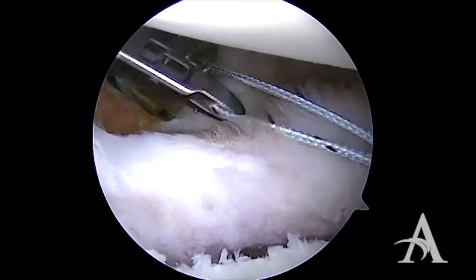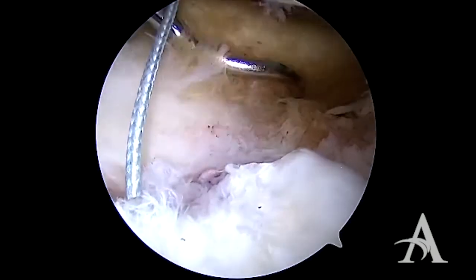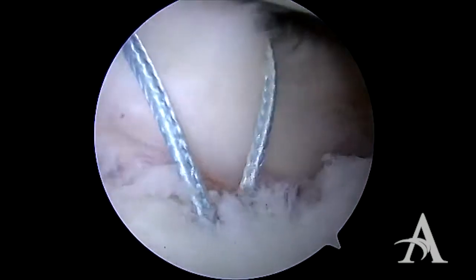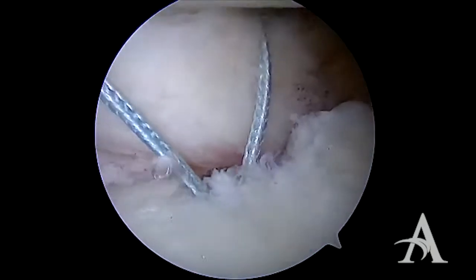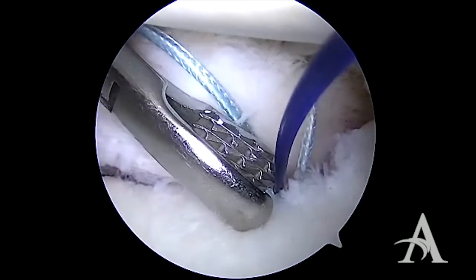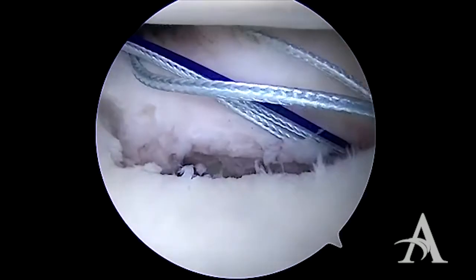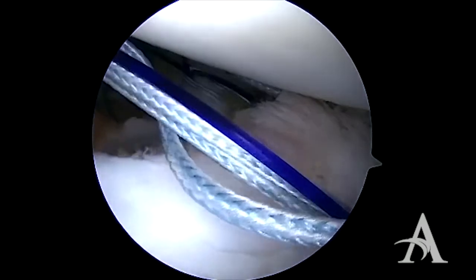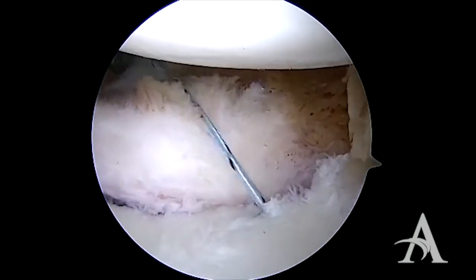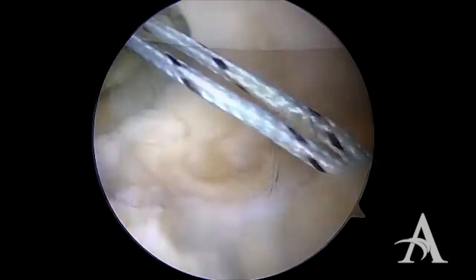We will then reach in from our anterior superior portal and pull one limb of suture. We will use a suture passer to grab capsule inferiorly and pass it up underneath the labrum. A number one PDS is used as a suture shuttle. It is pulled out of our anterior superior cannula, loaded with the suture, and passed back through our anterior inferior cannula. The knot is positioned appropriately to ensure that the soft tissues are shifted superiorly.